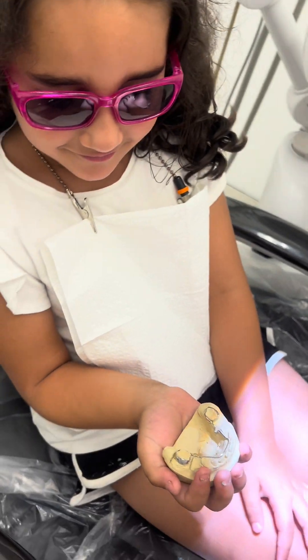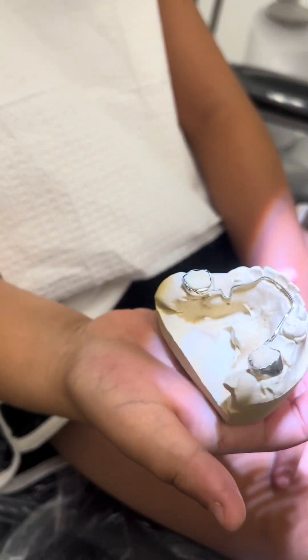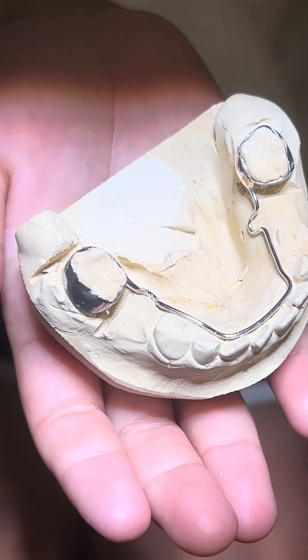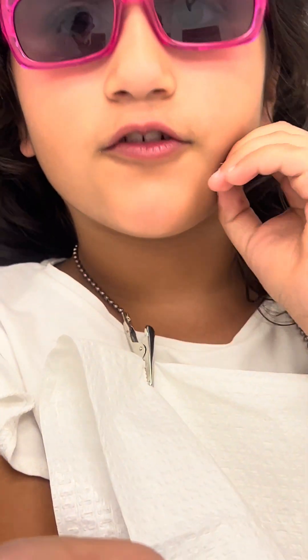Take it with you. Do you know what that is? It's something for your tooth. Can I see that? Don't move. What's this? It's something for your tooth when your tooth is coming out the other way — the wrong way.